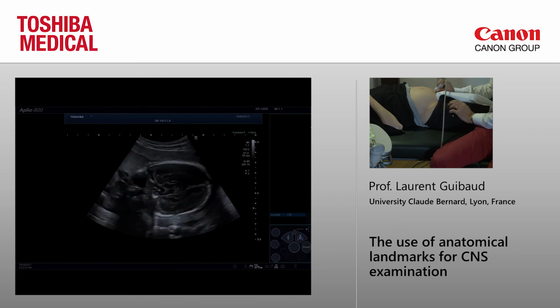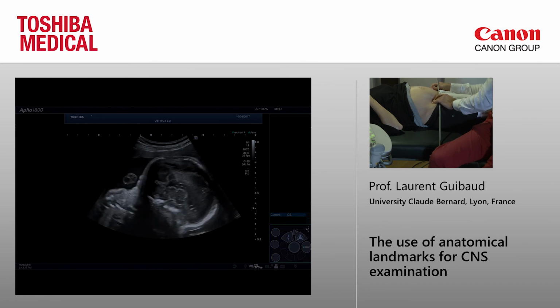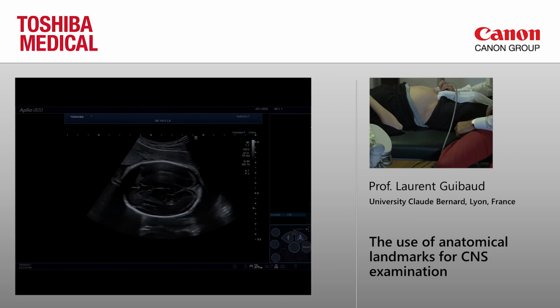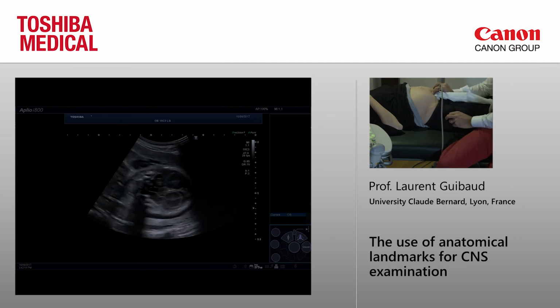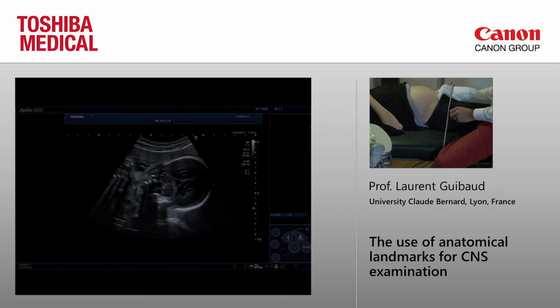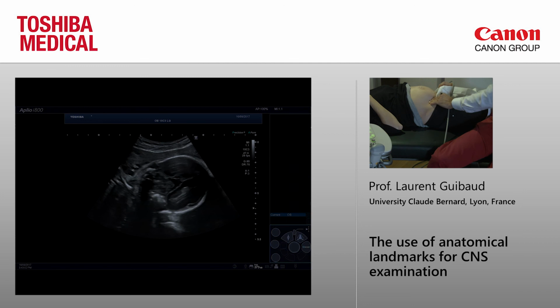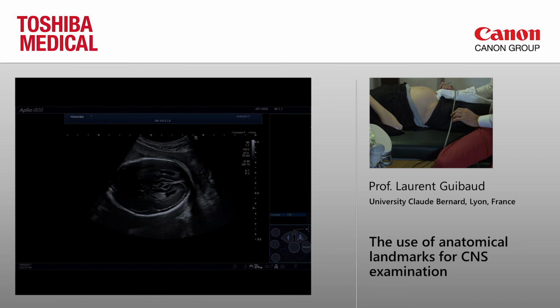Just ask me a question, I can continue like that. If you suspect that the proximal ventricle is enlarged, how do you measure it? This is a good question, because it's very difficult. You can do it on coronal view. You can try to do a coronal, but in that case, it will be difficult. Even if I try like that, I cannot turn the baby. I can try to have a look like this. I know that I'm a little bit oblique.